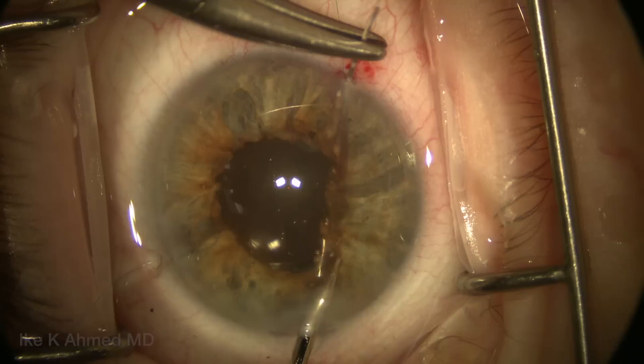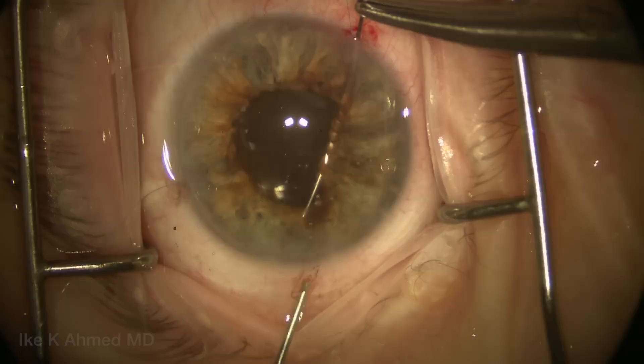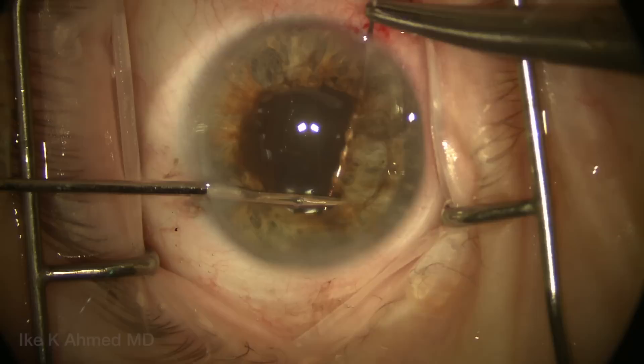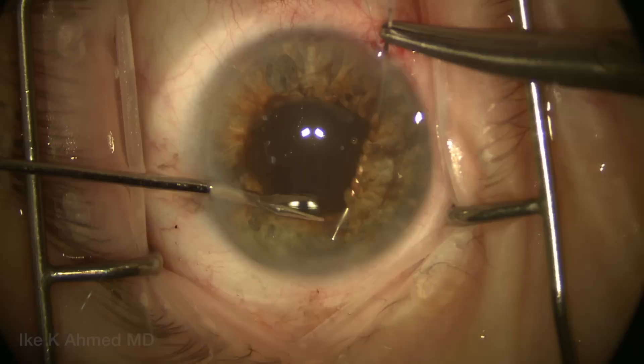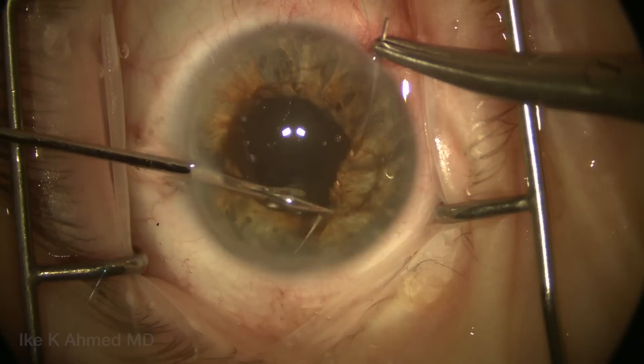We'll switch hands, now using the right hand to grab the needle, and inject some more viscoelastic as we approach the temporal incision. We use our superior incision with the micro grasper for a better approach, grabbing the iris and bringing it to the needle tip. Using multiple incisions and working out the best angle with micro instrumentation is helpful to access the entire iris and pupil edge for 360 degrees, using both right and left hand depending on which area of the anterior chamber we're working in.